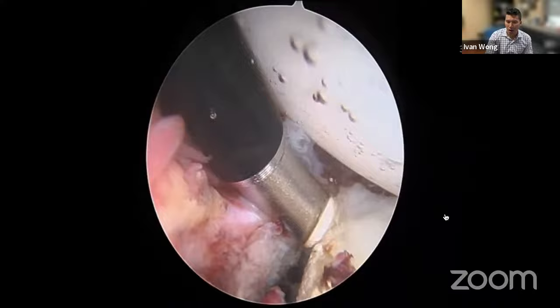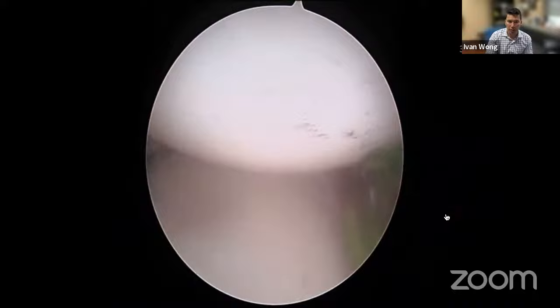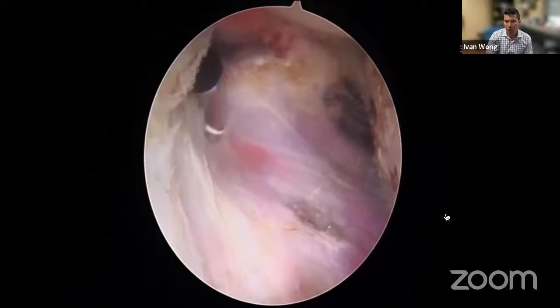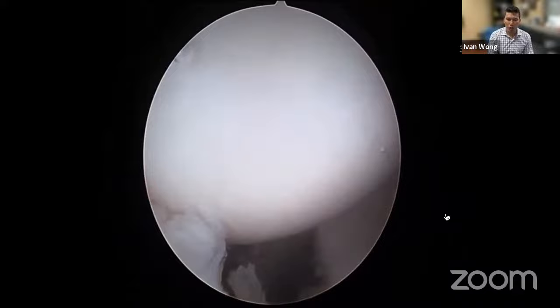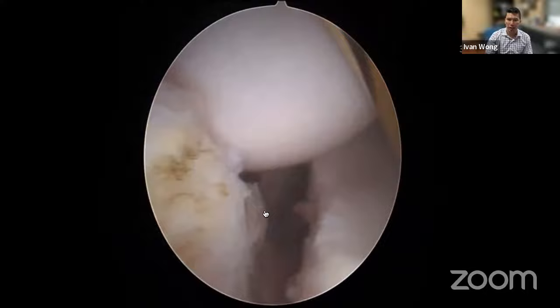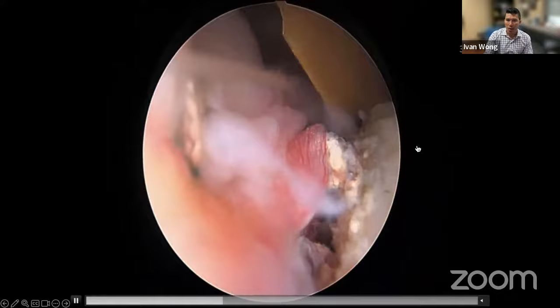I want to do a release past six o'clock — this is six o'clock here. I now switch to the liberator (Bankart) knife to extend the release past six o'clock. The cautery isn't stiff enough for this. I angle the hook toward the glenoid side to protect the nerve, which is more on the humeral side. Usually going to about seven o'clock; if there's a posterior labral tear, I continue all the way around to the edge of that tear. The capsulolabral complex down here looks stable, so this is not a circumferential or 270-degree tear — I just want release to seven o'clock for more room to shift the capsule anteriorly and superiorly.